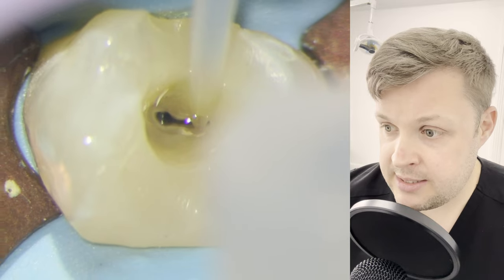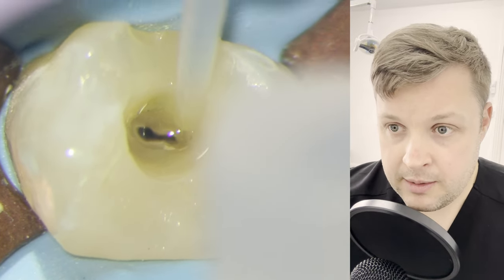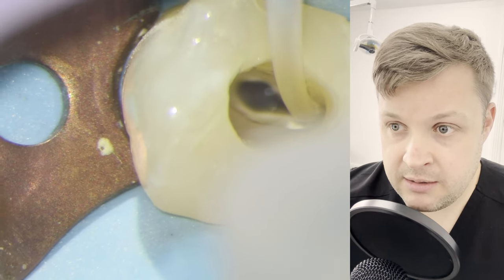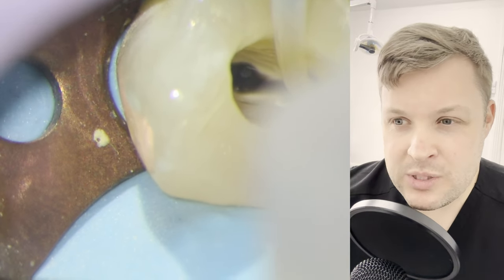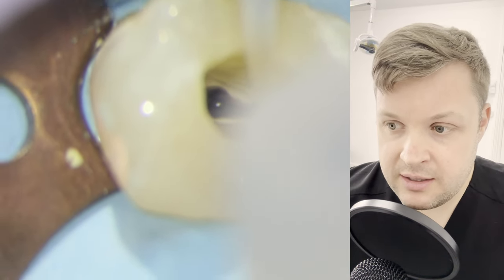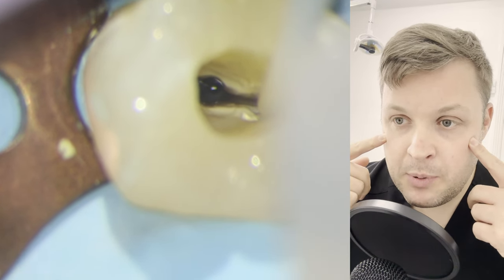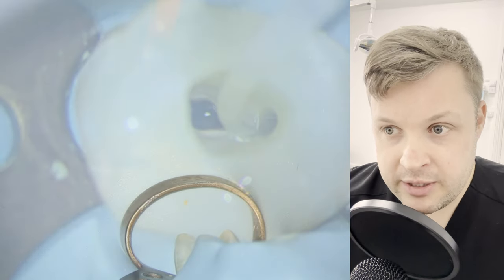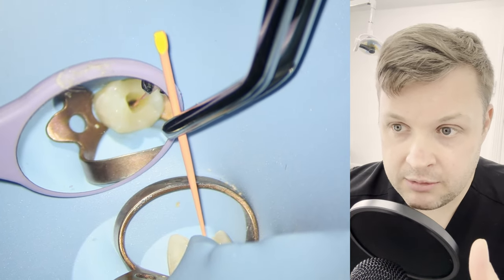I'm going to do the hypochlorite test again — just pushing hypochlorite into the canal space and sucking it out. You can see that the hypochlorite is draining in both canals, but when you look at the buccal canal, it doesn't drain completely. So in my mind it might be joined, it might not be — it might just be joined by some lateral canals.